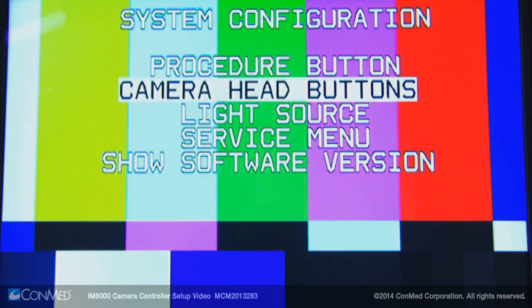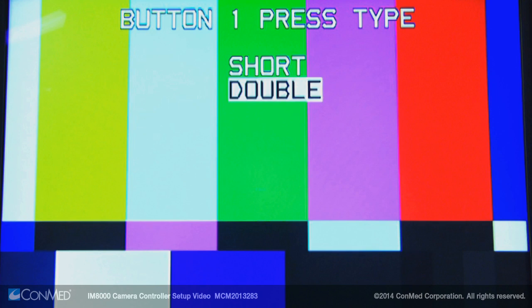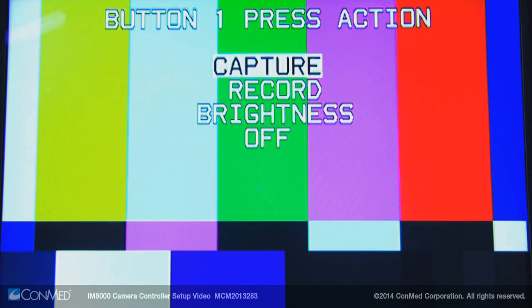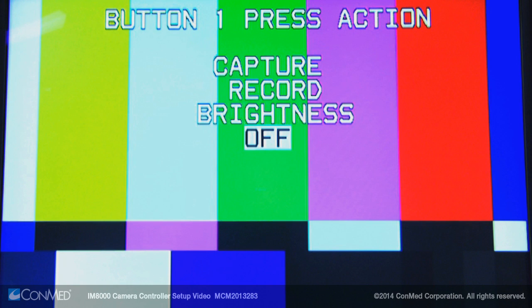Press the down arrow button and select button to enter the camera head buttons menu, which allows you to configure button one and button two on the camera head. Button one press type and button two press type allow you to choose between a short press or double press to perform an action. The button one press action and button two press action can be configured to either capture a still image, record video, adjust brightness, or have no action.